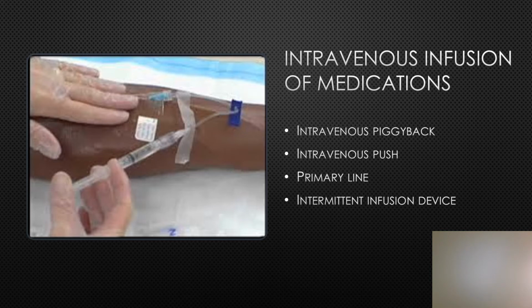Determine compatibility of medications or fluids that might be infusing in a continuous infusion prior to administration. If it's incompatible, it can cause precipitates or cloudiness. If it is incompatible, you have to flush before and after medication administration. Scrub the port between every flush, medication, or infusion.